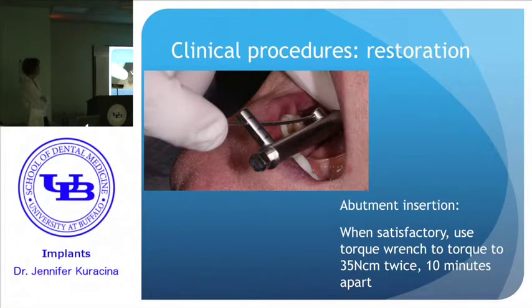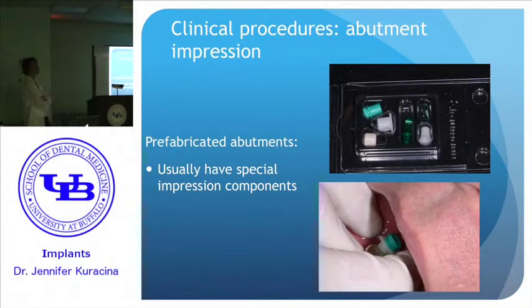Somebody was asking me if you can do it once, one visit, and then do it the second time the second visit. Yes, you can. It has to be at least 10 minutes apart. And you should write in the chart that you torqued it twice to 35.